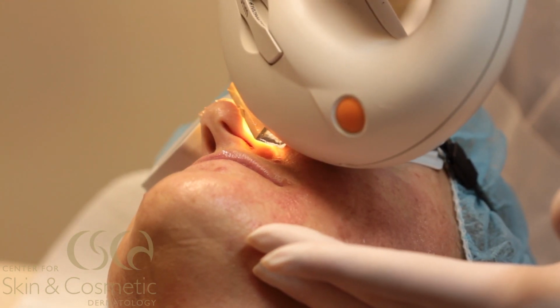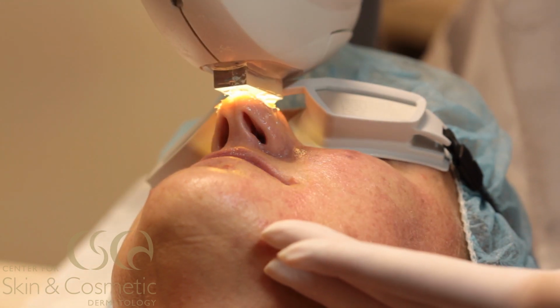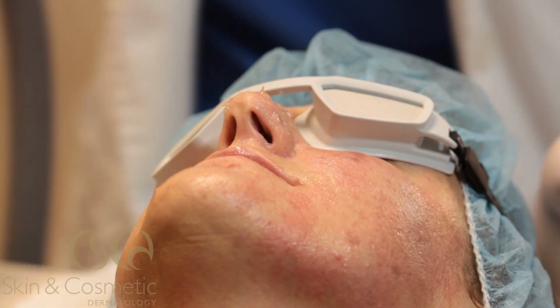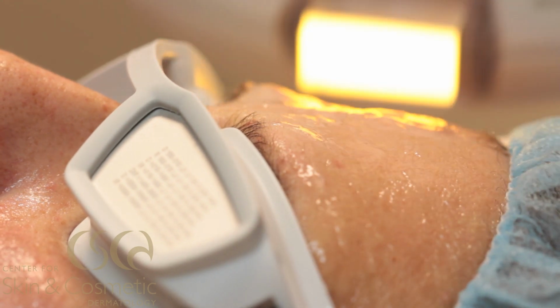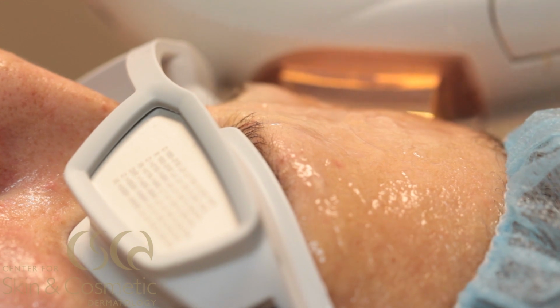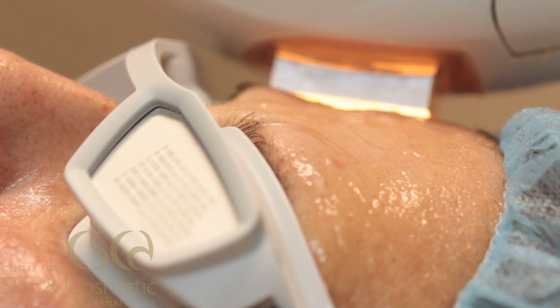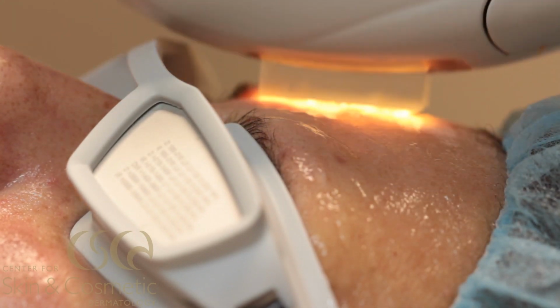Immediately post-treatment with the IPL, if you get a really great aggressive clinical response, it's a really good idea for patient comfort to apply a soothing gel, like a hydrating serum that may have some hyaluronic acid to it. It's something that we do for our patients on the half of the face immediately post-treatment when we turn them over to treat the other side, just so that there is an additional cooling benefit and it kind of soothes and calms the skin.